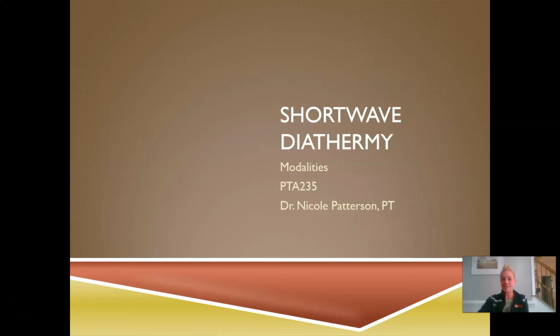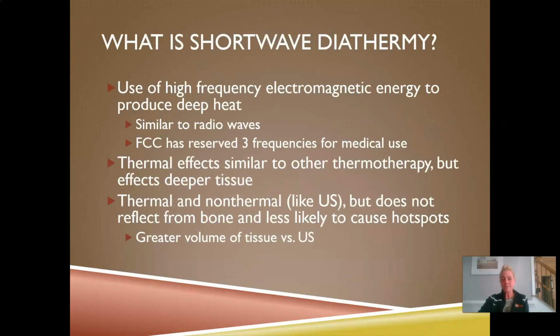Hi there. Our next topic is going to be shortwave diathermy, and we follow this after ultrasound because you'll see there is a lot of overlap or a lot of similarities between these two modalities. So shortwave diathermy, if you've never heard of it, and don't worry because it's not super common, so you may not have heard of it.